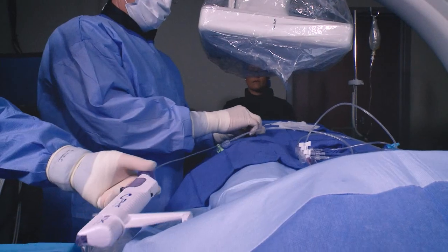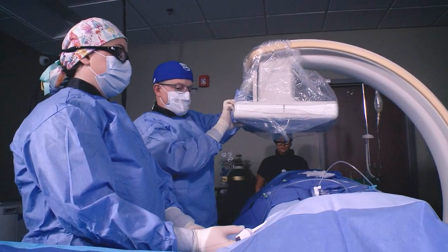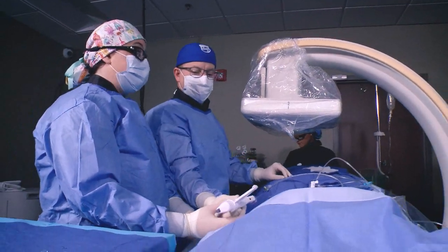As an interventional cardiologist, I'm fairly particular. One of the neat things about this unit is the ease with which it can be moved and the ease with which the angles can be changed.